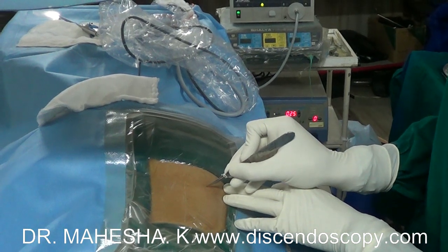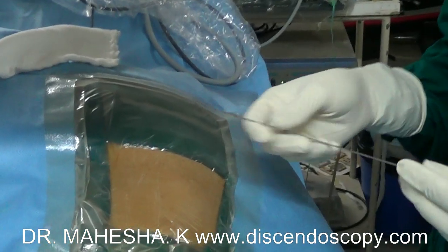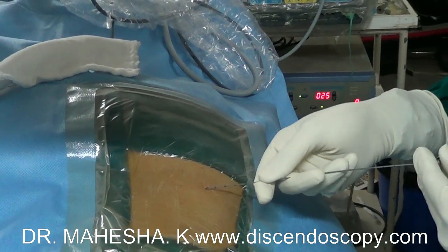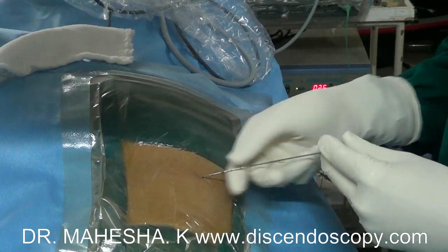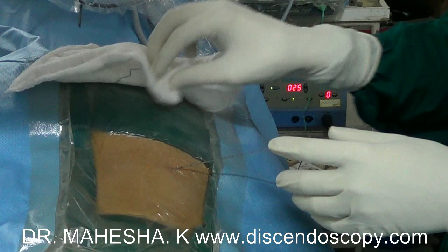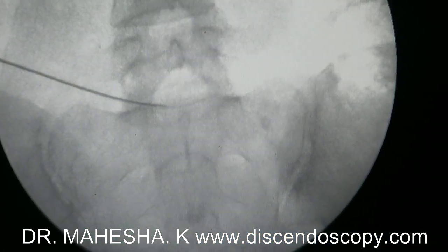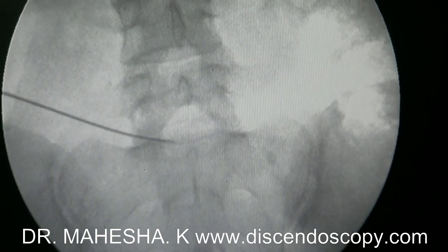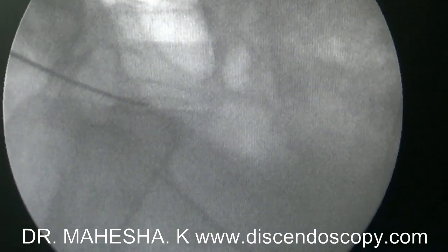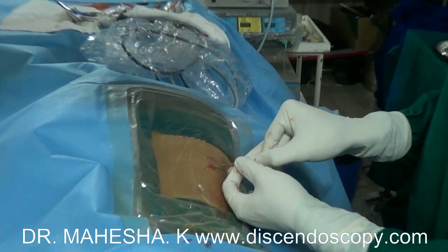The surgery is done under local anesthesia. Patient is positioned prone over a radiolucent table. Here I am taking an entry point which is 12 cm lateral to midline above the iliac crest on the left side. An 18-gauge initial puncture needle is inserted into the L5-S1 disc space.